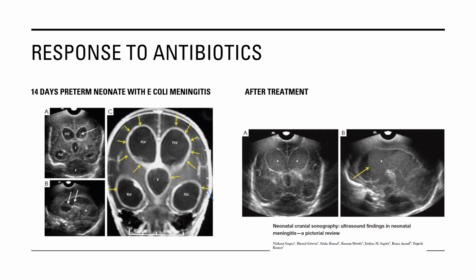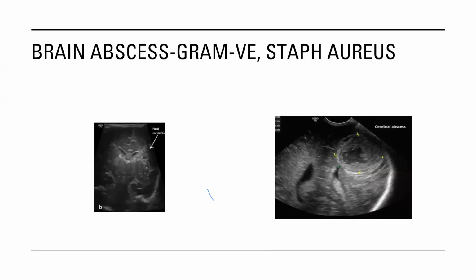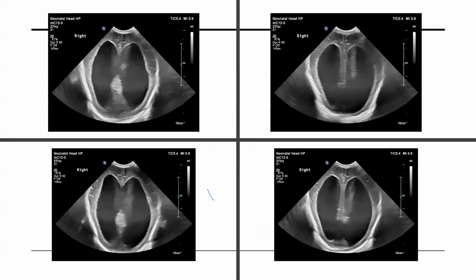So in essence, this is a short summary of what infection looks like. I would really ask, for those of you who basically are working in India, if you're able to share scans, because these are the most difficult scans in the UK. It's very difficult. I was just wondering, Maria, have you seen any cases of cerebral abscess in Milan? Yes, Klebsiella. And then I've seen a case like this with ventriculitis and this hydrocephalus with a meningococcus B. And one was strep B.